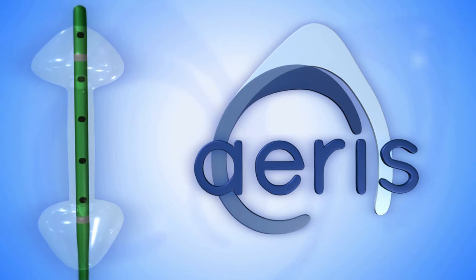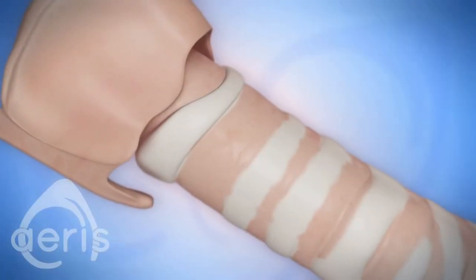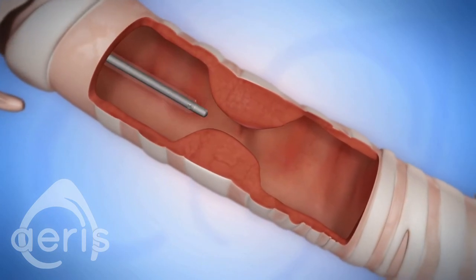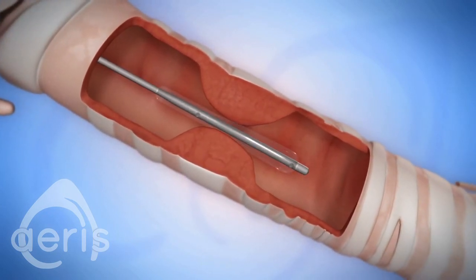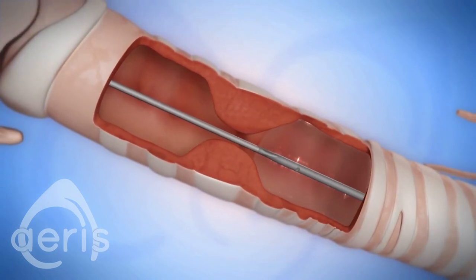The aeris balloon catheter is designed specifically for the unique challenges of dilating airway structures. An effective airway dilation procedure must be completed safely and expediently. However, slippage of the balloon catheter as it inflates is a common problem, resulting in extended surgical time or an abandoned case.